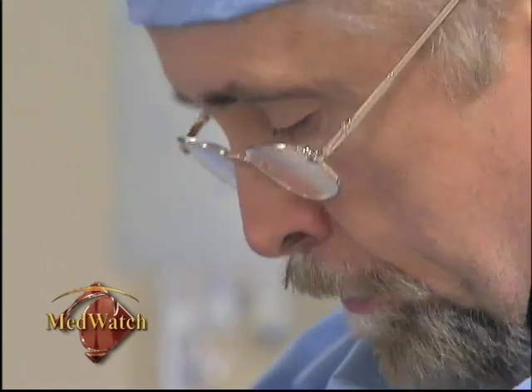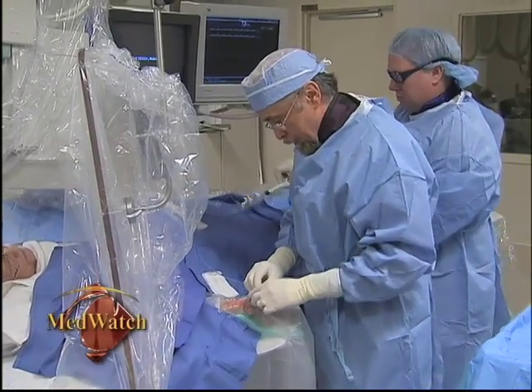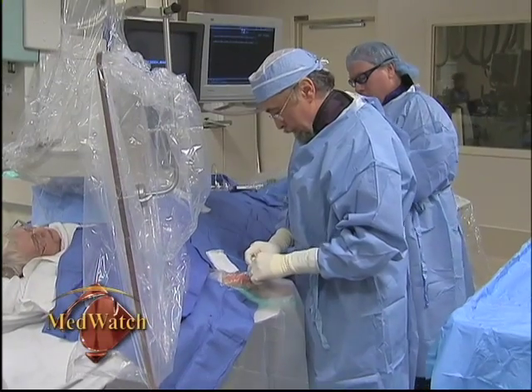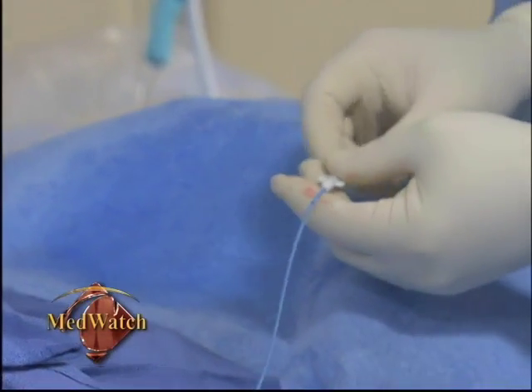Since the radial procedure uses a smaller artery, it reduces the chance of bleeding complications, and Dr. Ambrose says it tends to be much more comfortable for the patient. When you get a patient that has had a femoral procedure or a groin procedure, and then he has a wrist procedure, I would say 100% of the time they say, oh my goodness, this is so much less painful. It was great. It was a walk, you know.